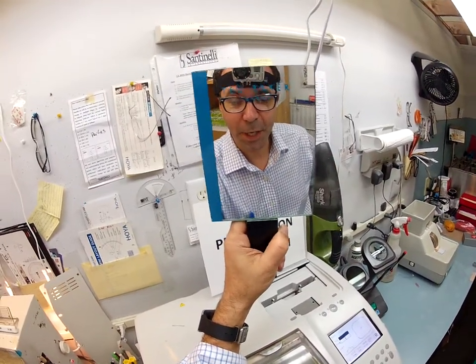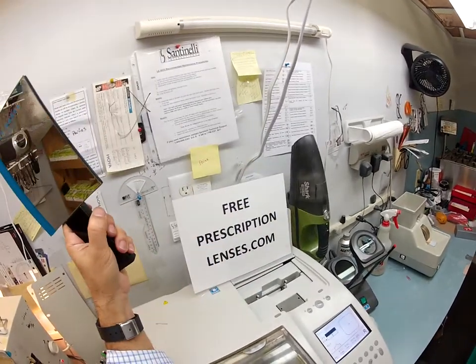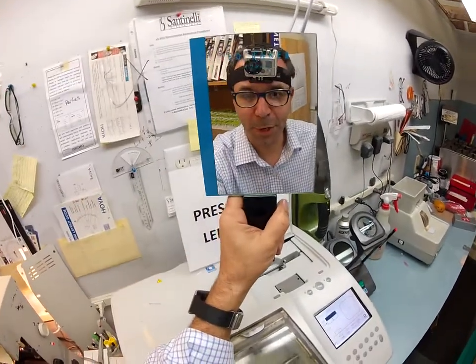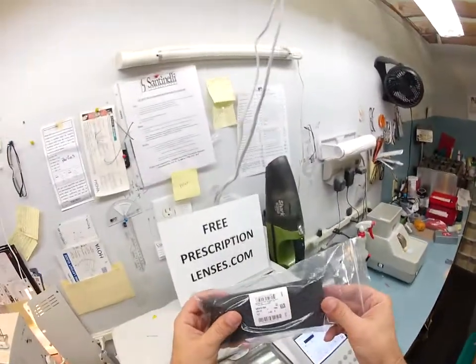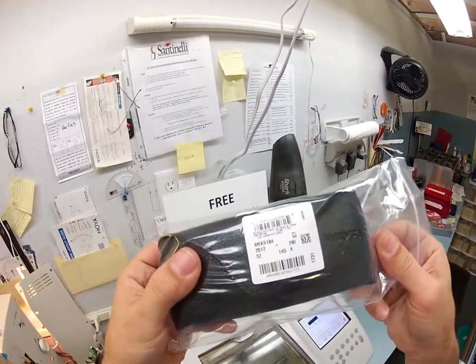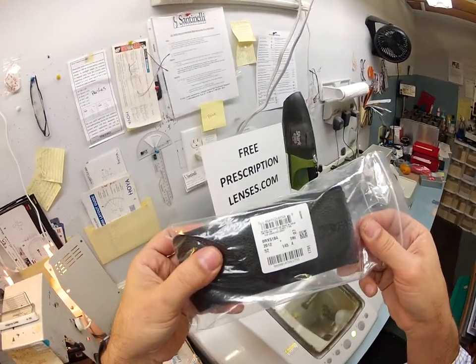Hello Scott in Clinton, Queensland, Australia. It is Matthew here at freeprescriptionlenses.com and with the help of my GoPro camera, I'm going to show you how I cut clear lenses with anti-glare coating for your Ray-Ban 5184 color 2012, which is the dark Havana, in size 52.